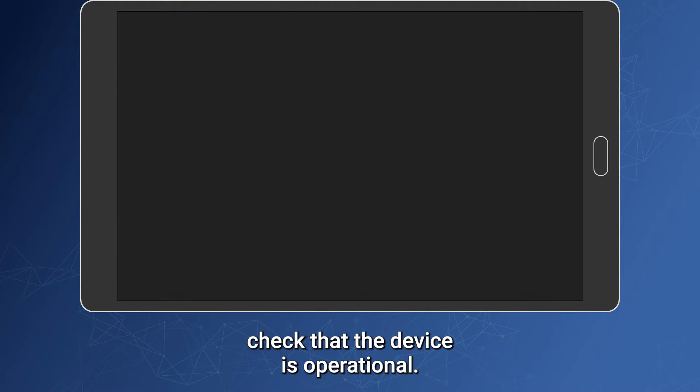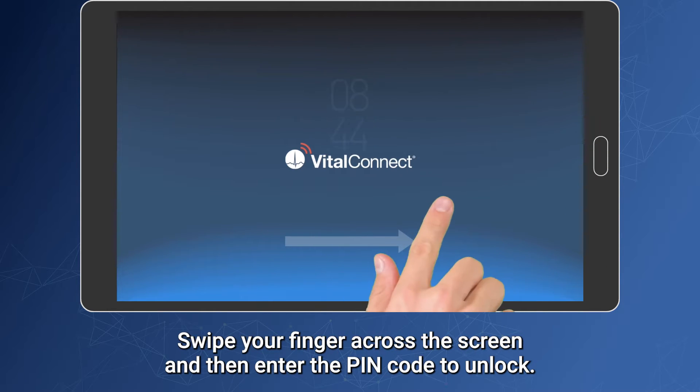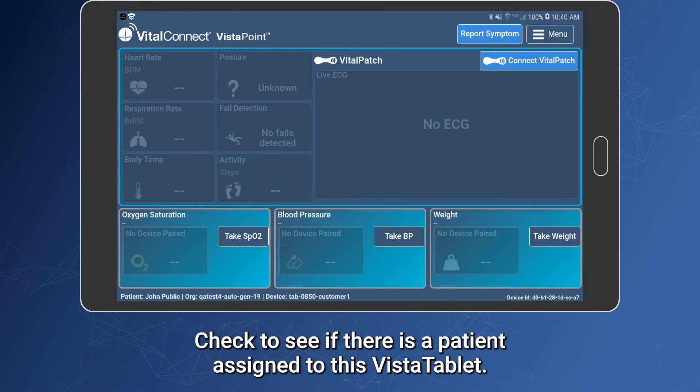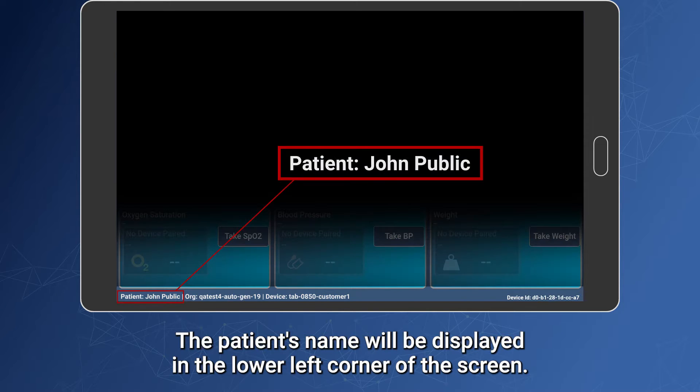Before using the Vista tablet device, check that the device is operational. Press the home button to wake up the device. Swipe your finger across the screen and then enter the pin code to unlock. Check to see if there is a patient assigned to this Vista tablet — the patient's name will be displayed in the lower left corner of the screen.